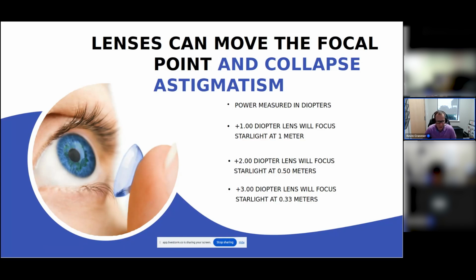If you just go through the algorithm and you are not thinking about where the focal point is, then you won't really be able to understand what you're doing, and it makes it much more difficult to refract. It won't make sense to you. So think about where the focal point is, and I'm going to come back to this in the future when we start thinking about the mechanics of refraction. And we're going to make sure that we understand exactly what we're doing with that focal point.